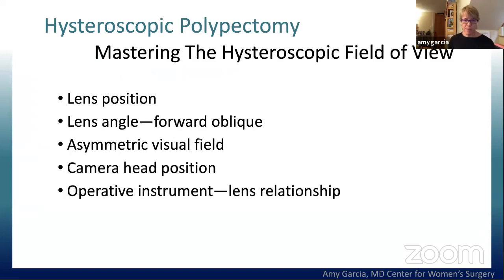And first, that is really about mastering the hysteroscope, because there are a number of components that really must be understood in order to, I think, really facilitate these procedures. And what I am presenting is all done in the office and not in the operating room, which also becomes important when having an awake patient, is to really understand the mechanics of the hysteroscope.